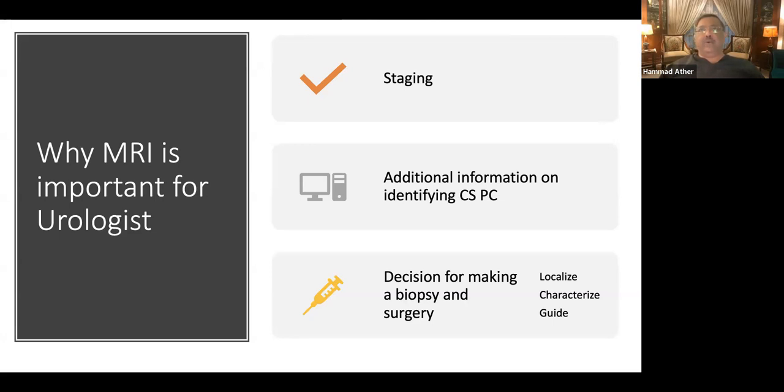MRI is making big inroads, and MRI will ultimately become a very important source in identifying prostate cancer which are aggressive and which are clinically significant and require treatment. So it is at the moment not included in most guidelines, but I'm sure it will sooner or later. So it helps us in staging the disease, local regional disease staging for nodal disease as well as the original prostate cancer. It also provides additional information about clinically significant prostate cancer.